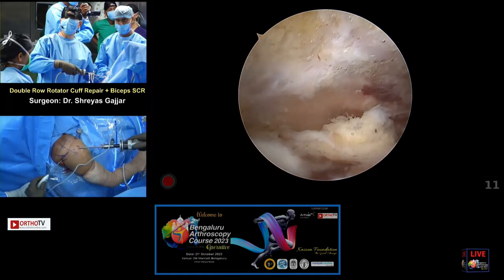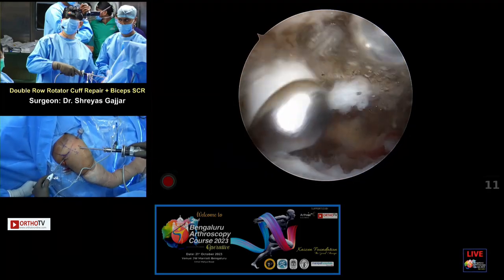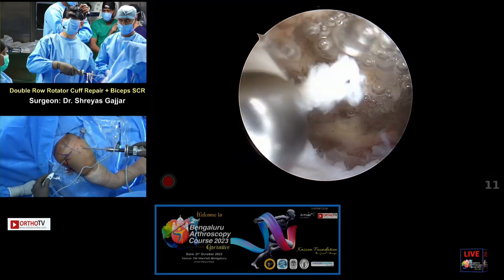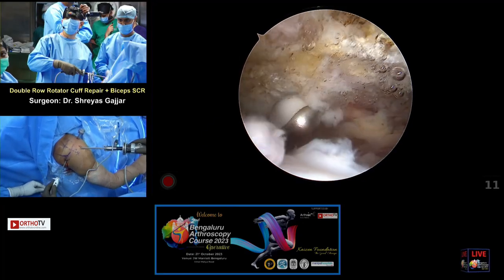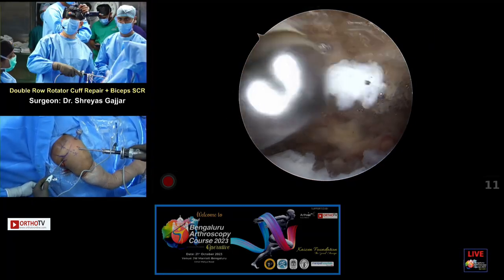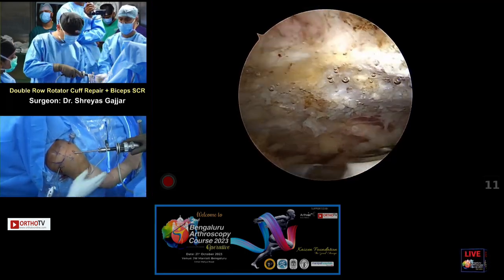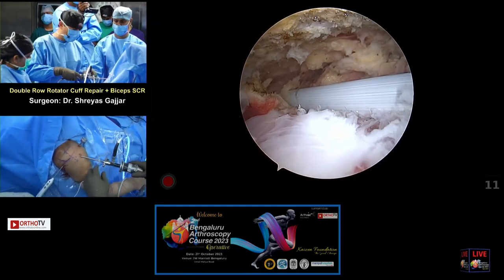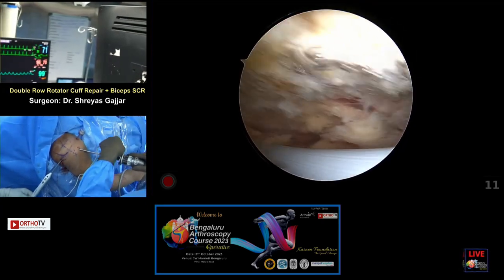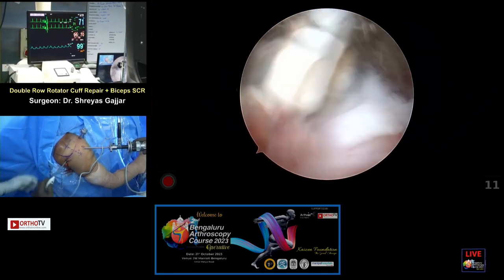It's a good field so far, good anesthesia, which is extremely important. And we are using a pump as well. And we have the 4K system here for a good quality vision. So you can see the cuff tear slowly coming in the picture. So I'll just clear the bursa a little bit. Then I'll complete my acromioplasty.